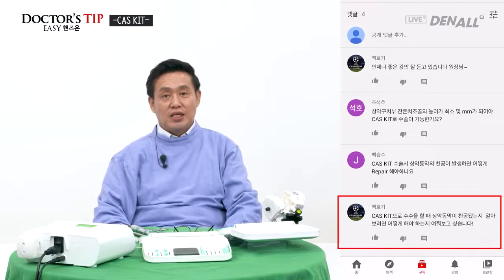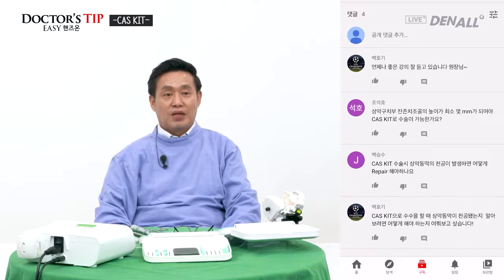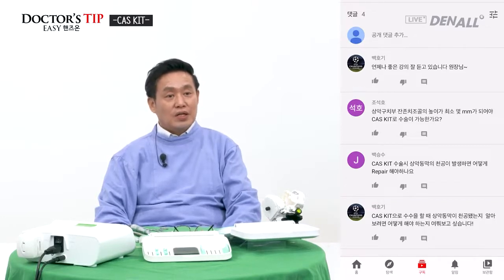That means short implants can be placed, or a lateral approach forming a window can be used to see the perforation directly with your eyes and do some repair and continue with the surgery. If you cannot do this lateral approach, you should stop the surgery and you need to wait 3 or 4 months to try it again. I don't know whether that answers your question.